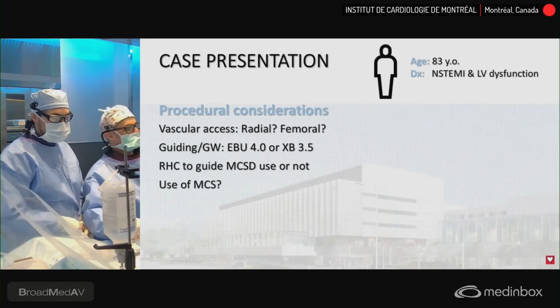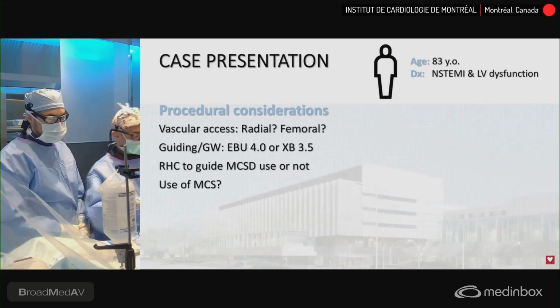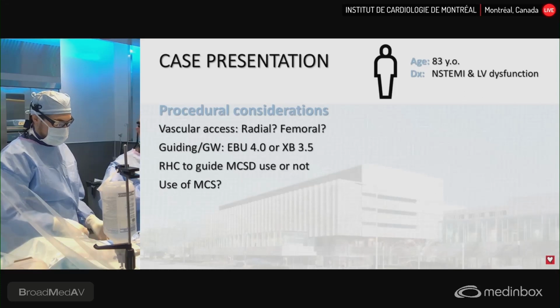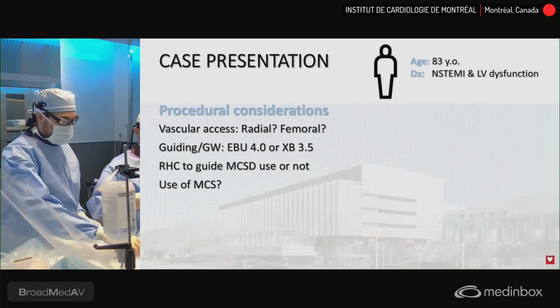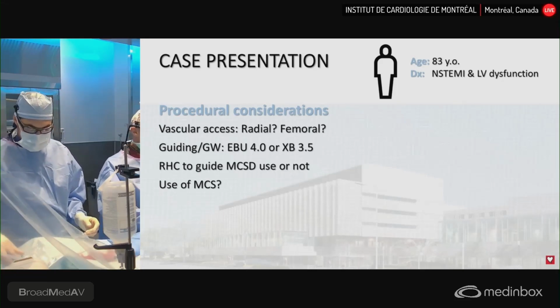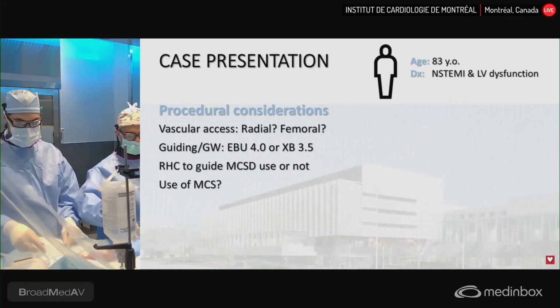OK, we're going to take another IVUS, please. Another brand. It doesn't work. The IVUS doesn't work? Refinity, please. So we're having some technical issues. The Opticross. OK, we have some issues with the IVUS, so we'll redo. It says hardware error, we changed captain.